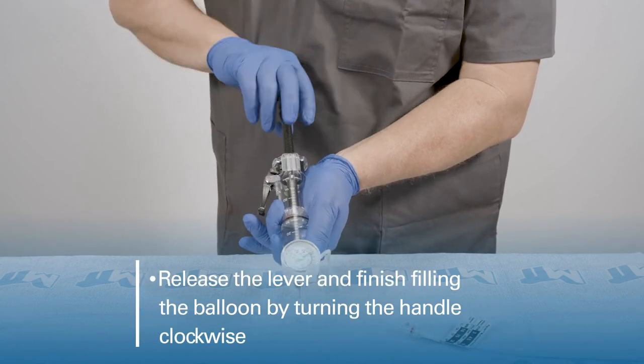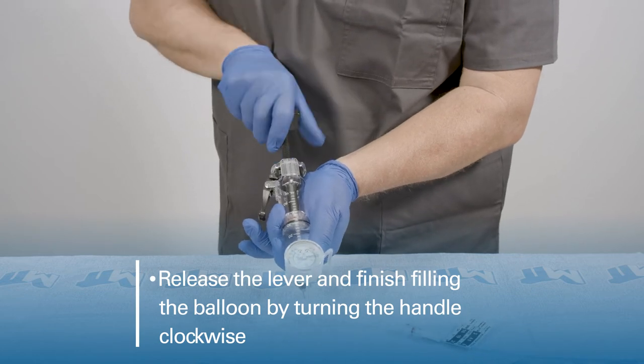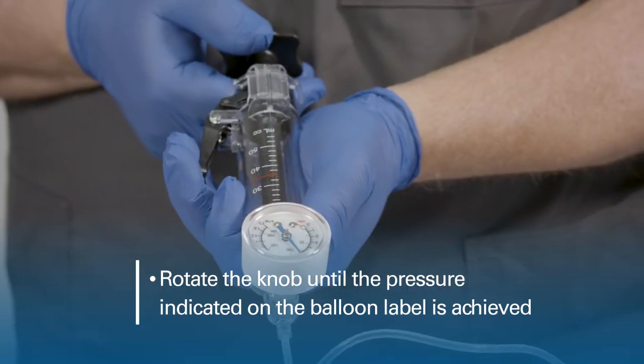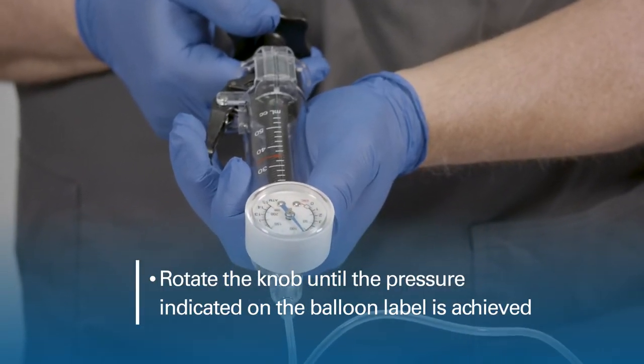Release the lever and finish filling the balloon by turning the handle clockwise. Rotate the knob until the pressure indicated on the balloon label is achieved.